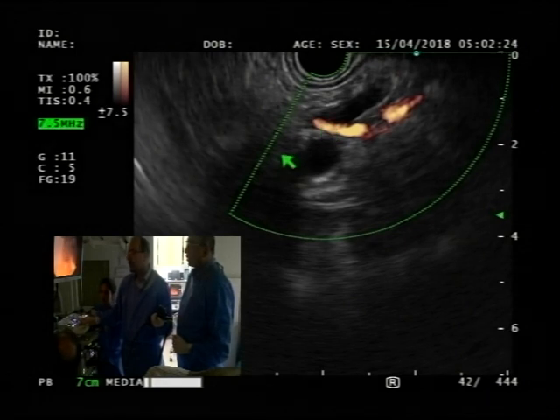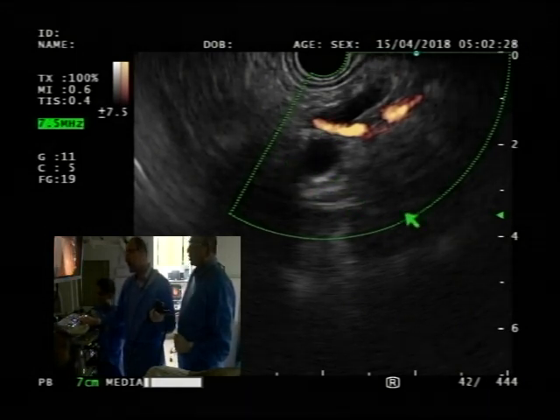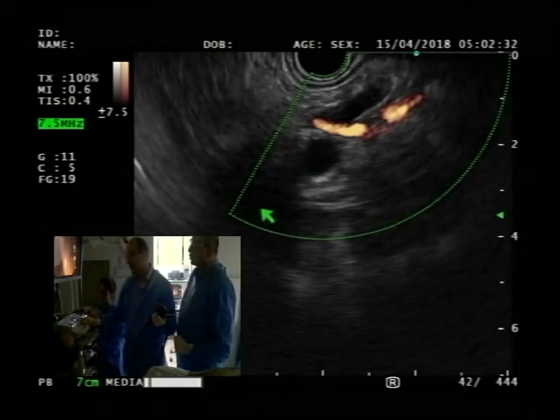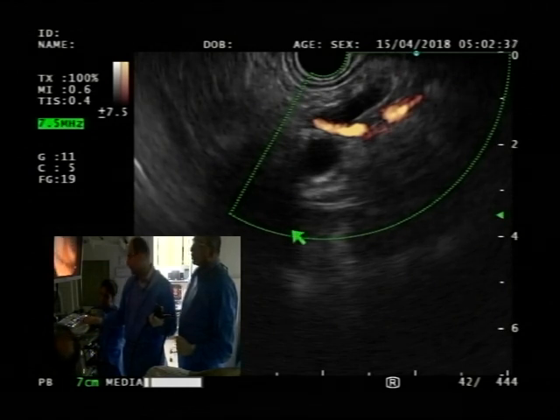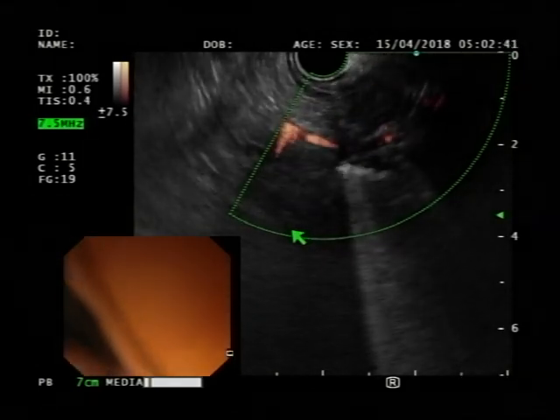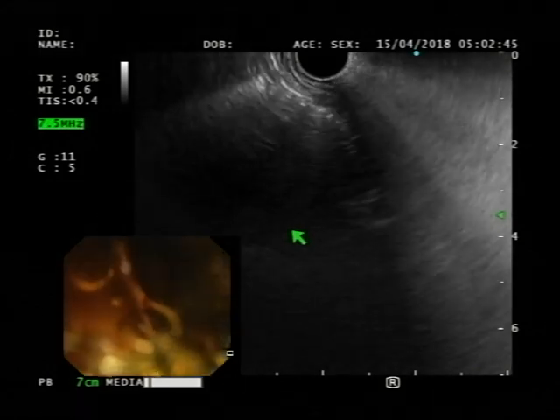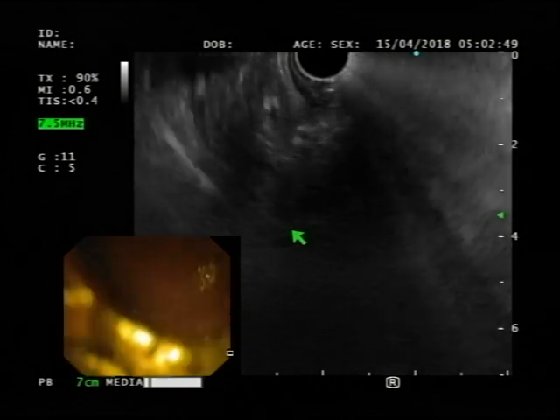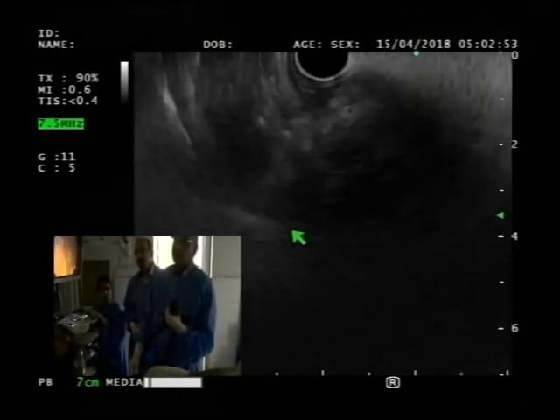But basically, your portal is going to go down this way, the bile duct's going to go this way, liver is going to be up here. Your pancreatic duct and your bile duct are then going to meet down this way, and then you'll get the pancreatic head here. Okay, so how about we move forward to now the bulb? So you go endoscopically, yeah? Yes, absolutely. Just like ERCP, you're aiming to do the sunset view, and go from there.